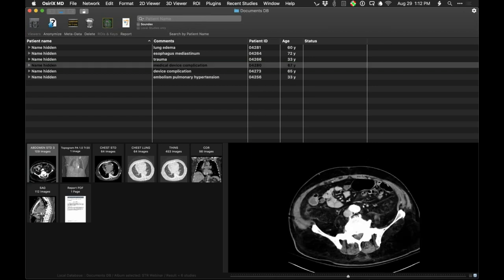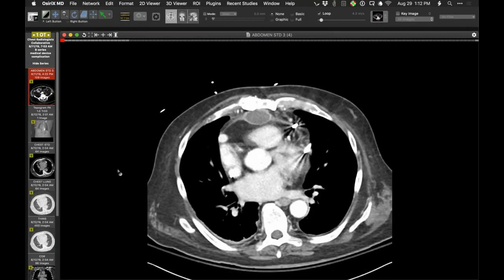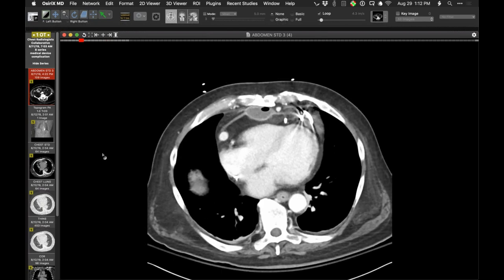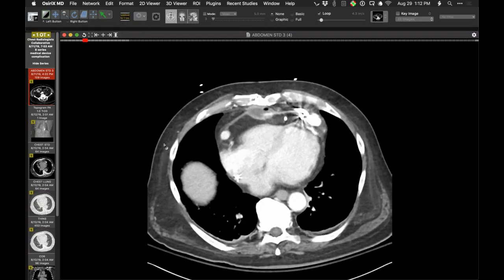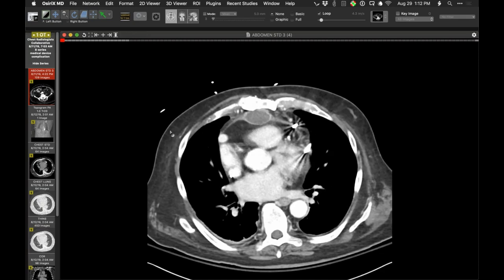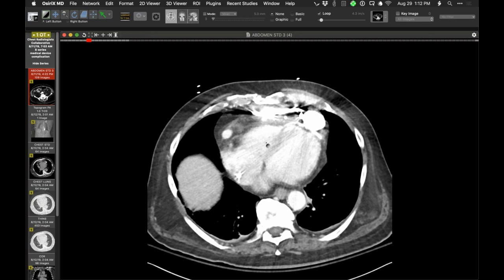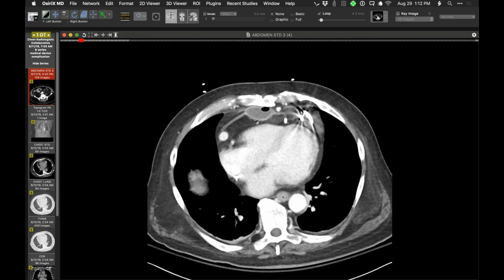This is a patient who had an LVAD placed some years ago — this is not soon after placement of the left ventricular assist device. The patient came in ill. This is part of the abdomen imaged on the 11th, and I'll show a CT from the next day. What this abdominal CT shows very nicely are findings consistent with an abscess. Here is the driveline, and in close proximity to the driveline and just above, findings very consistent with an abscess.